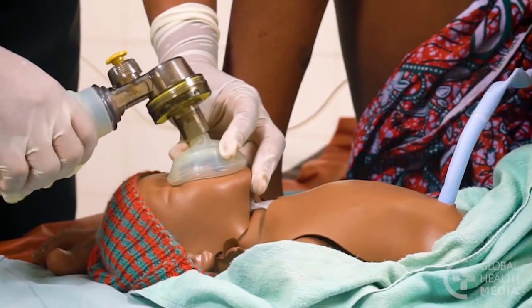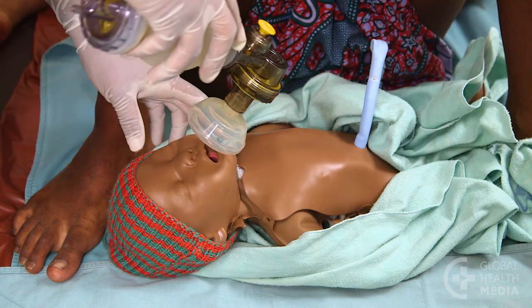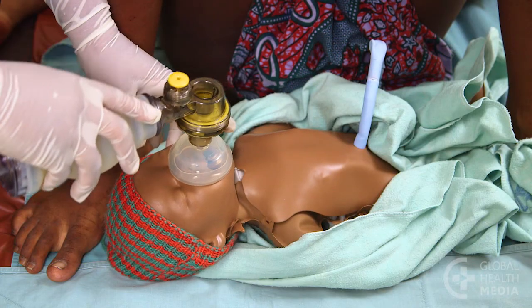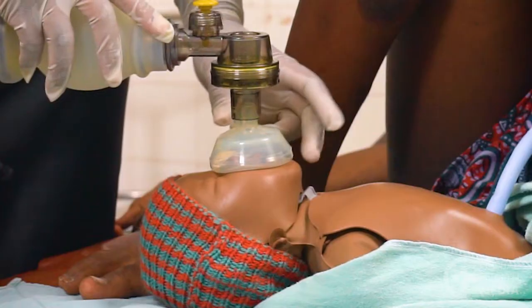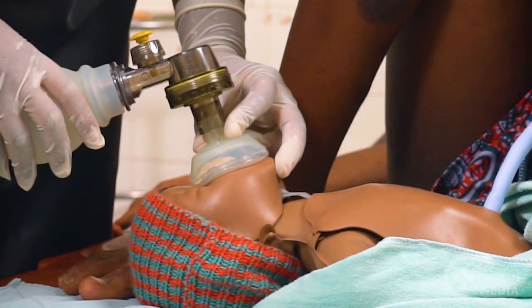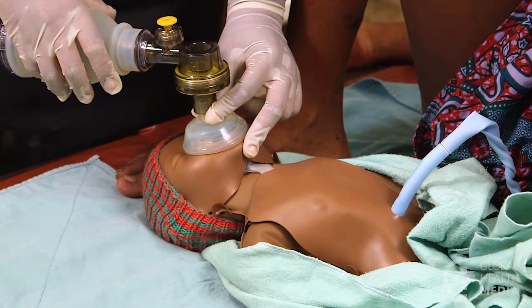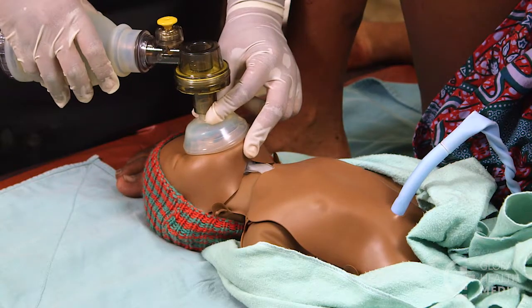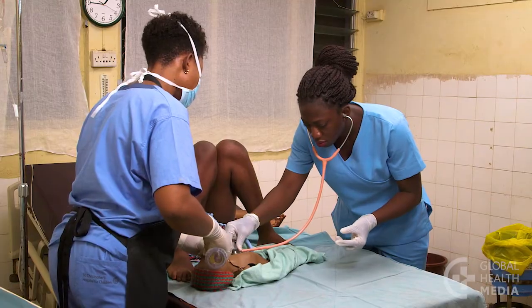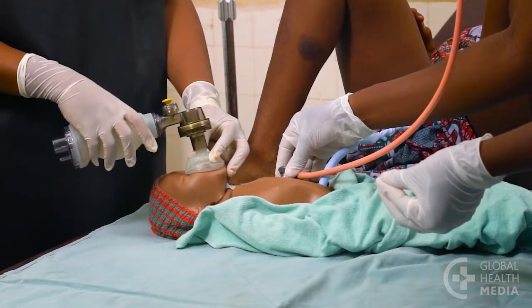Let's see the positioning of the mask one more time. Place the rim of the mask just below the baby's mouth, roll the mask over her mouth and nose, then make a tight seal by holding her chin up as you press down on the mask. Squeeze the bag smoothly to make the chest gently rise. If the baby does not begin to breathe and has a normal or a slow heart rate, improve and continue ventilation.